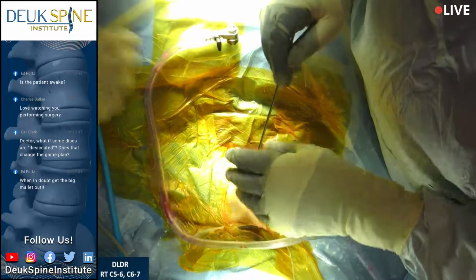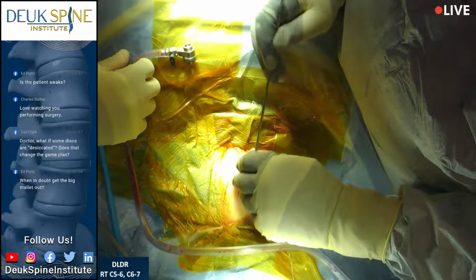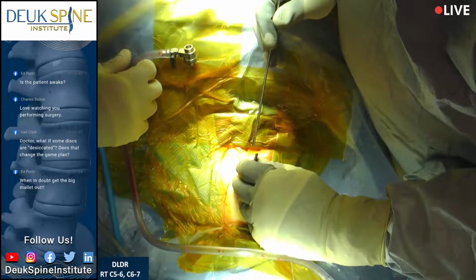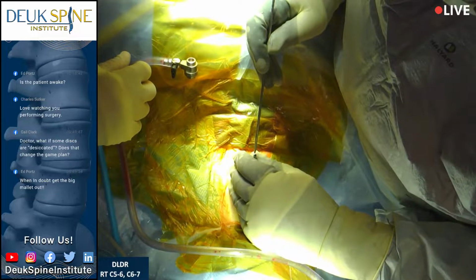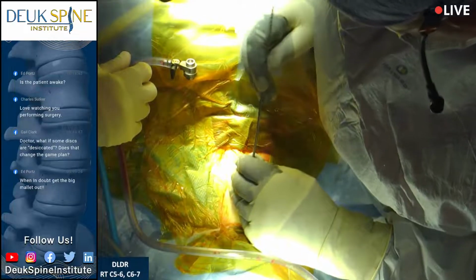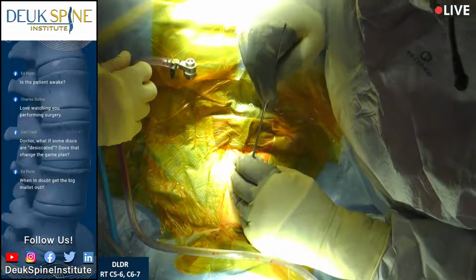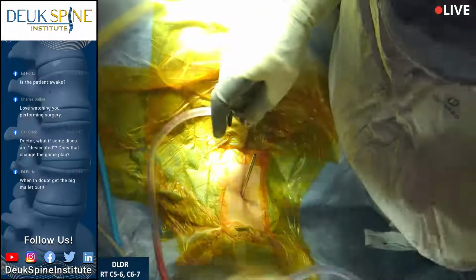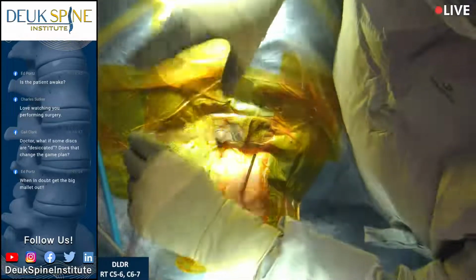So this is what we call the MacGyver moment, where this happens in surgery. Doesn't matter what kind of surgery you do. You're always going to have challenges with the equipment or with the anatomy of the patient that you have to overcome. And this is what separates good surgeons from bad surgeons. Those that are able to adapt to their environment as the environment adapts versus those that don't.